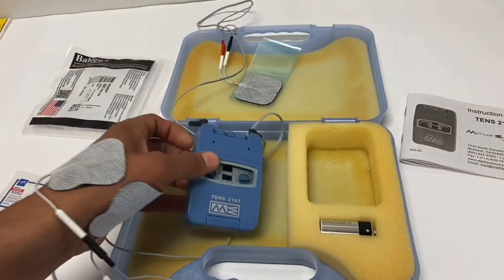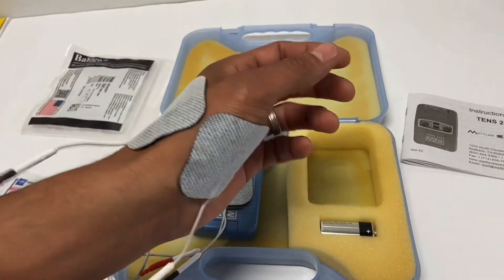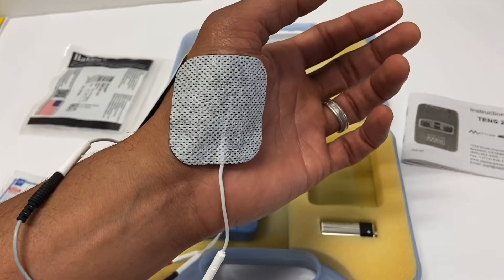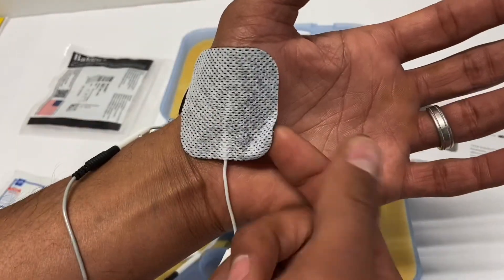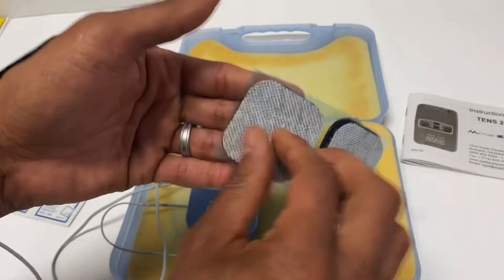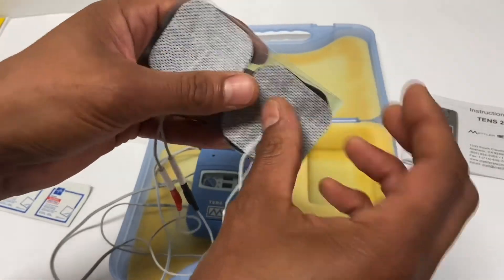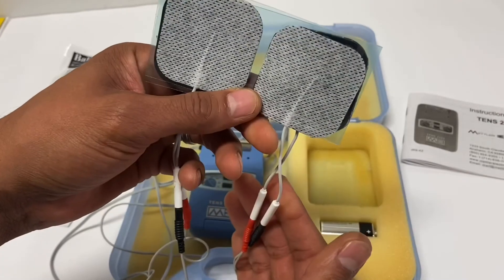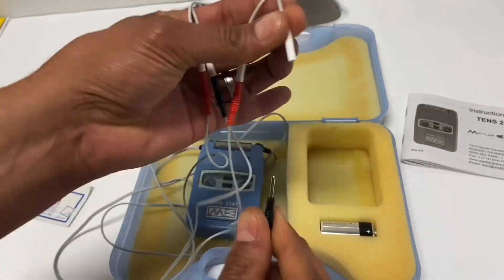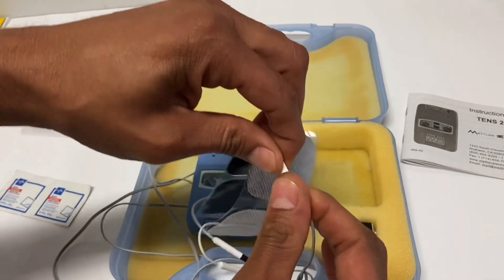My suggestion is to play around with the unit on yourself so you understand what different settings feel like — you'll be better at explaining it to your patients. When removing the pads, same concept as putting them on: do not grab from the wire and pull. Find a spot that's already loose and slowly peel it off, then reapply to the backing. These pads are good for about 30 uses if you're prepping the skin well; with lotion use they won't last as long. Always remove electrodes by holding near the pad and pulling gently — not yanking.